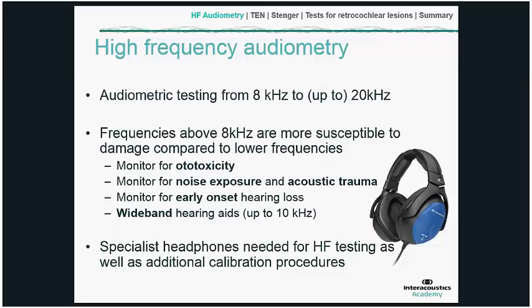Another one would be monitoring for the early effects of noise exposure or acoustic trauma for those who might work in a noisy environment, for instance. Monitoring for the early effects of age-related hearing loss, and also if there is a need from a management point of view, managing a patient with a hearing loss, to fit a wideband hearing aid for some particular reason.